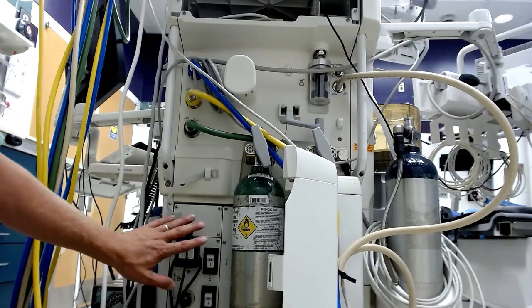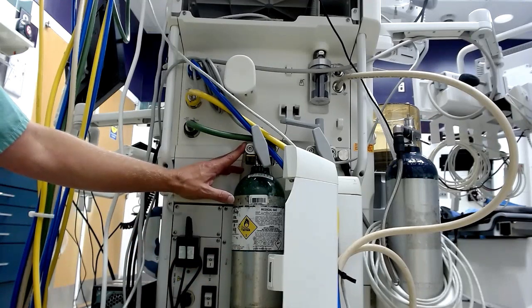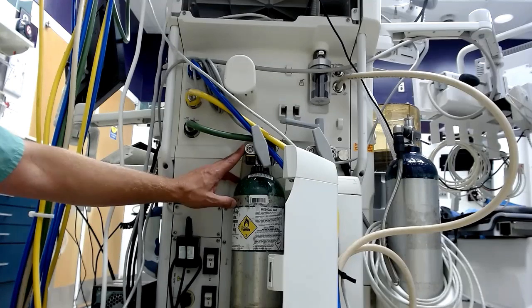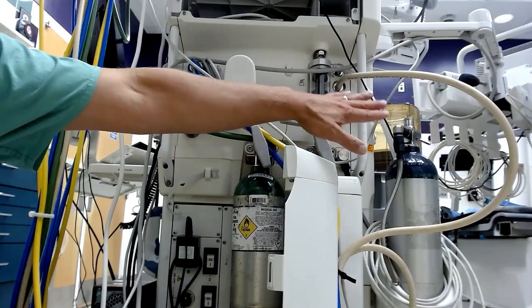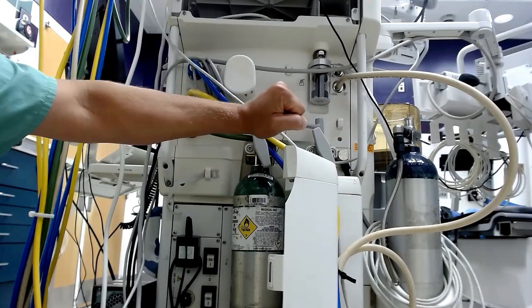Moving over to the side, you're going to also see an oxygen tank here. This is connected to the hanger yoke. We'll try to get you a good picture of the hanger yoke and also the pin index safety system and so forth with the cylinders that we discussed also in the lecture. And then you're also going to see other cylinders. We've got air over here, which is in yellow. It's in the housing unit. And then far over here, we've got nitrous oxide, which has a blue top to it.